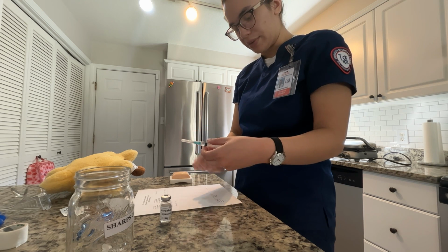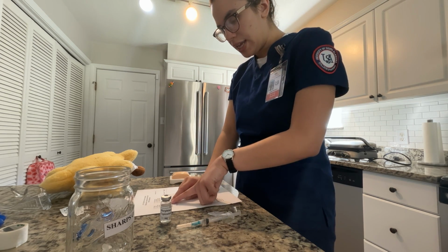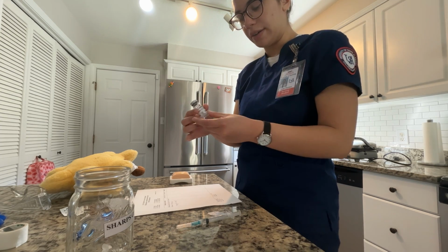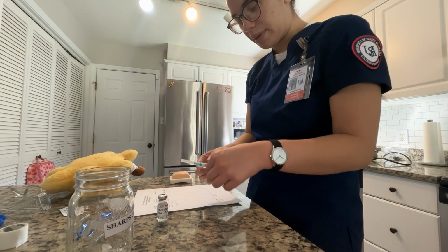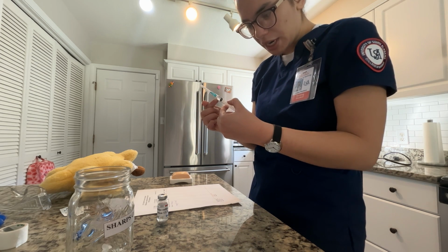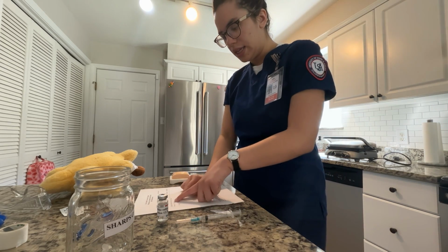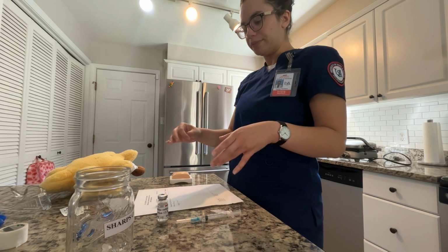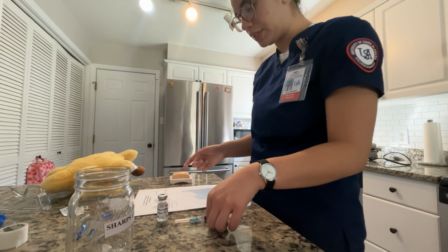And then it also says Jaguar J. Jones on my syringe. He is to receive 5 milligrams. So here I have a 10 milligram per milliliter vial. And on my syringe, I have 5 milligrams per half a milliliter. And then in my syringe, I drew up half of a milliliter. He is to receive this, and then I had to convert from milligrams to milliliters. So I got 0.5 milliliters, which I have here in my syringe.